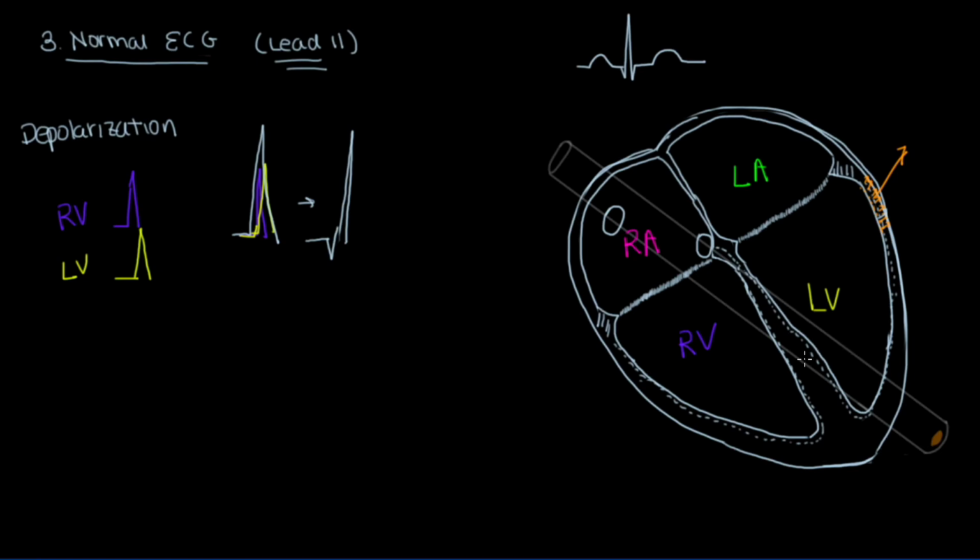So again, if you were to kind of bring this lead and place it right next to here to see what part of the charge's movement is the lead able to actually see, we can go like this, draw another one down here, an example here, a sensor with the overall charge moving almost perpendicular, but slightly actually upwards.